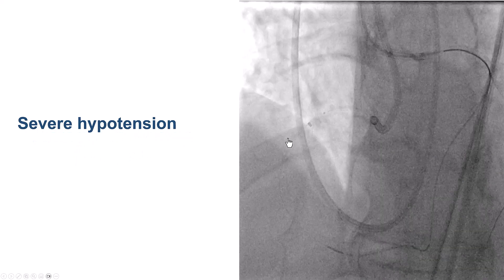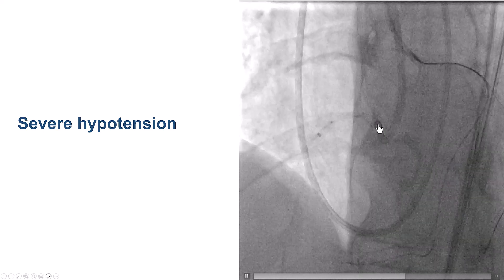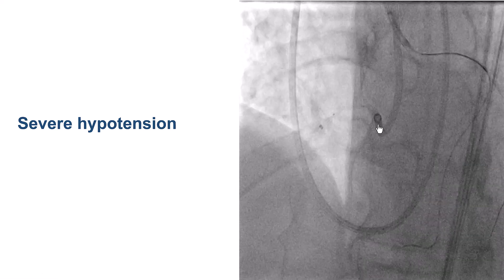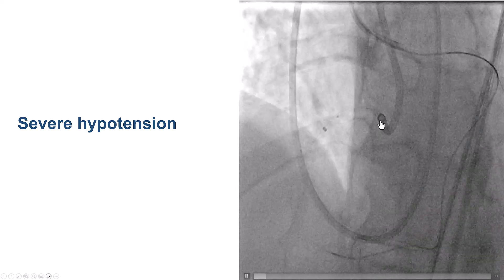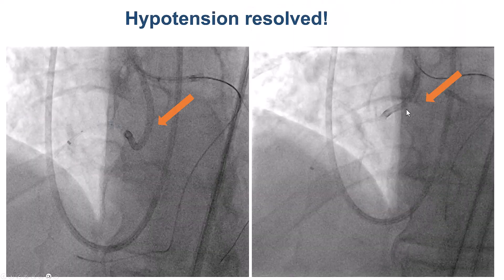At this point, the patient developed severe hypotension, which corrected after pulling the guide back. This is one of those subtle but potentially dramatic events where the guide catheter can lean against the aortic valve, causing severe aortic regurgitation. All we did was pull back the guide catheter, and the hypotension immediately corrected. When there is sudden onset of hypotension and the guide is low on the aortic cusps, the easy way to check is to simply pull the guide back — if it is causing aortic regurgitation, there should be immediate correction of hypotension.